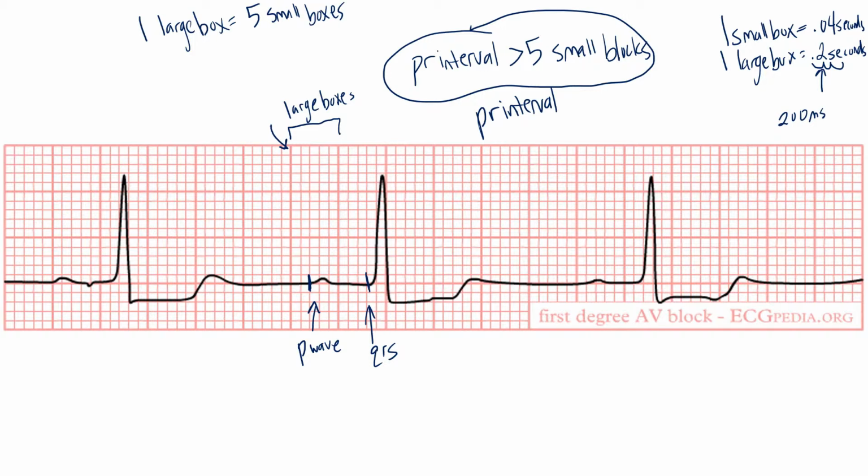So let's look right here at this patient who presumably has a first degree AV block. Let's count the blocks here. Starting from there, you have 1, 2, 3, 4, 5, 6. So you see how there's an extra block. This is telling you that this is already pathological.